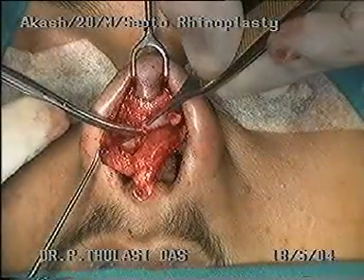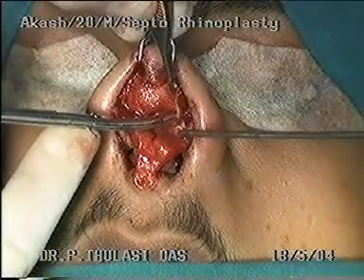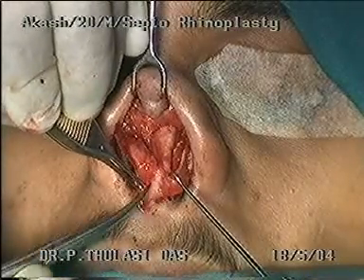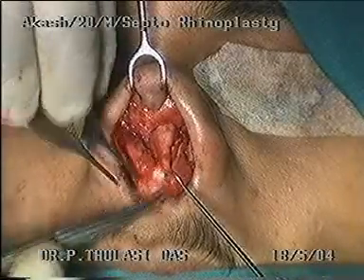At this point one can excise the cephalic part of the lateral crura. After the excision, we proceed to skeletonize the septal cartilage. This is done by separating the two medial crura through the membranous septum.